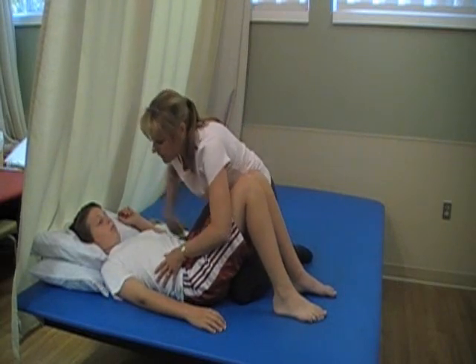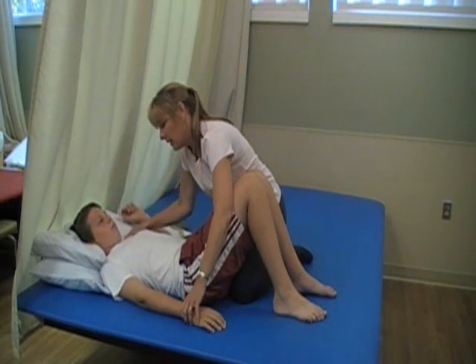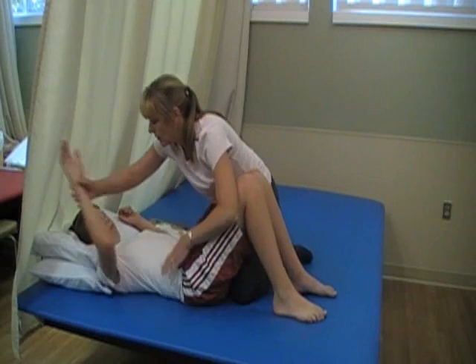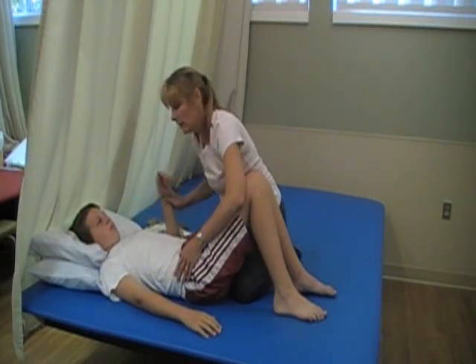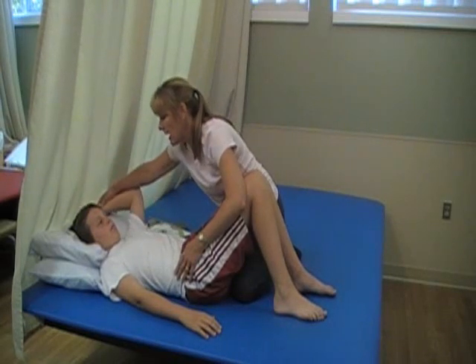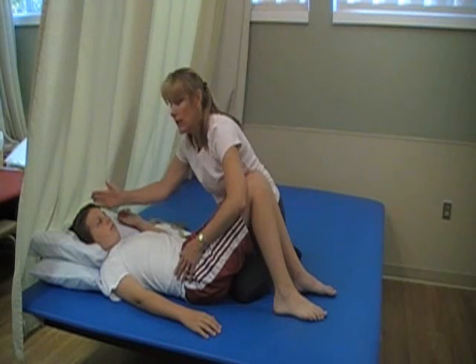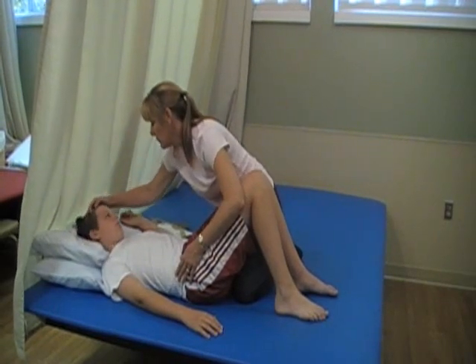The other thing you want to look at is scapular excursion and position on both sides. Upper extremity range of motion, again on both sides. Then the other thing you want to note is how does the arm influence the head? When you move the arm, does the head change positions? Then you want to look at the head range of motion.